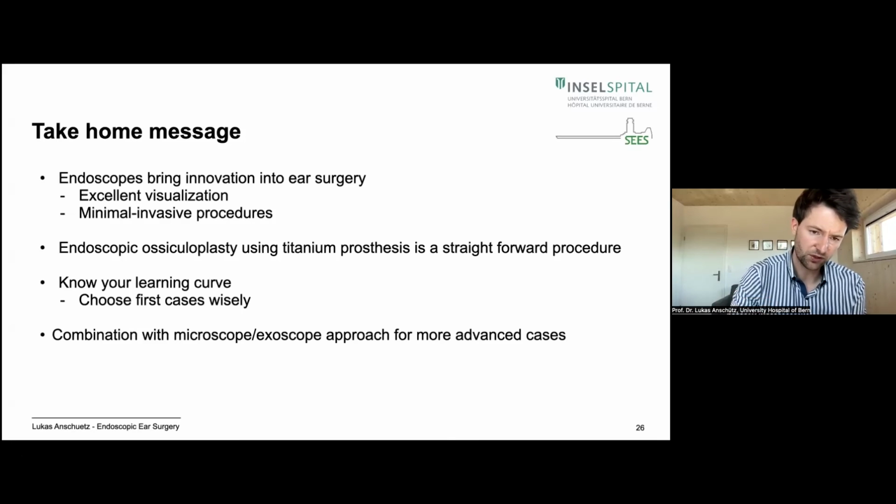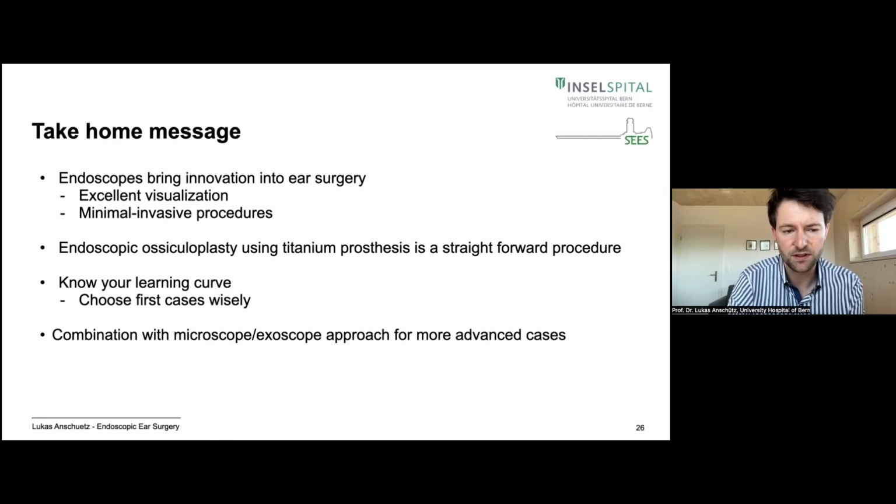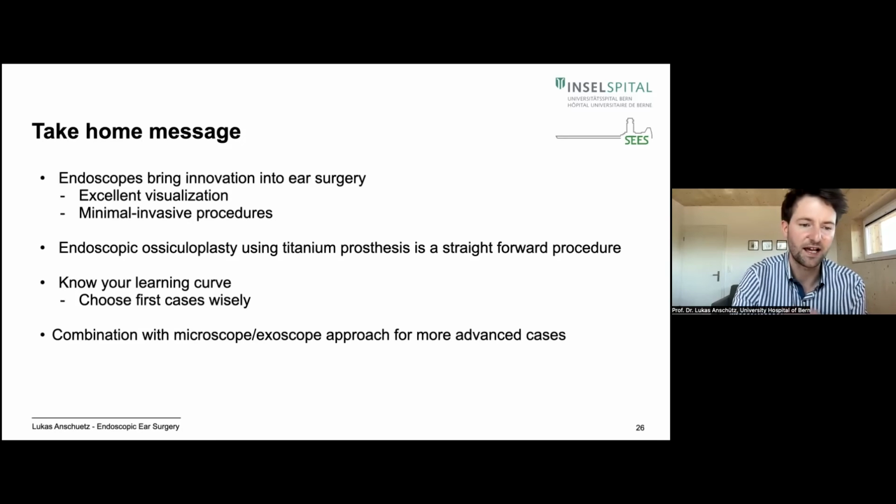And it is very important that you know your learning curve. If you start off with endoscopic ear surgery, even if you have a lot of experience with ear surgery, you should probably not start with stapes, but start with a tympanoplasty, with a good canal, with a posterior perforation, a left side if you're a right-handed surgeon. And you need to know the microscopic or exoscopic approach for the bigger cholesteatoma.